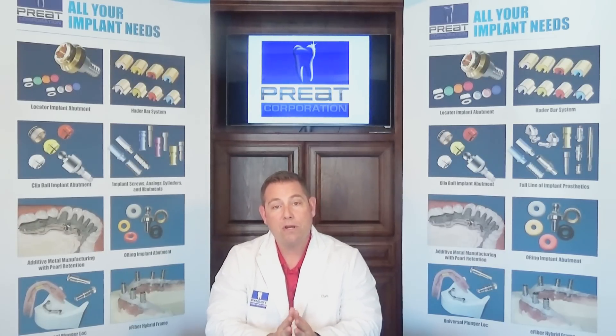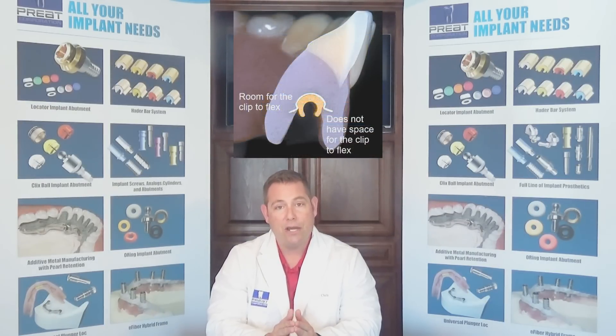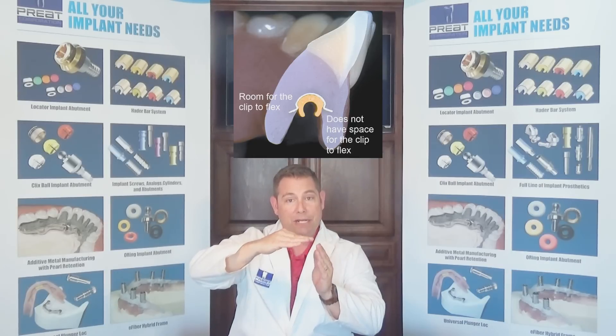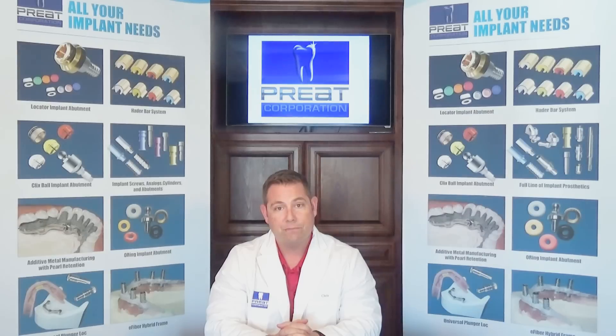The number one call we get is the clip is bending or rolling in. Take a look around the side of the flange of the Hater clip and see if there's any excess acrylic, debris, food, or calculus buildup that is prohibiting that clip from flexing during insertion. The green processing clip needs to be used both during chair side and laboratory processing.